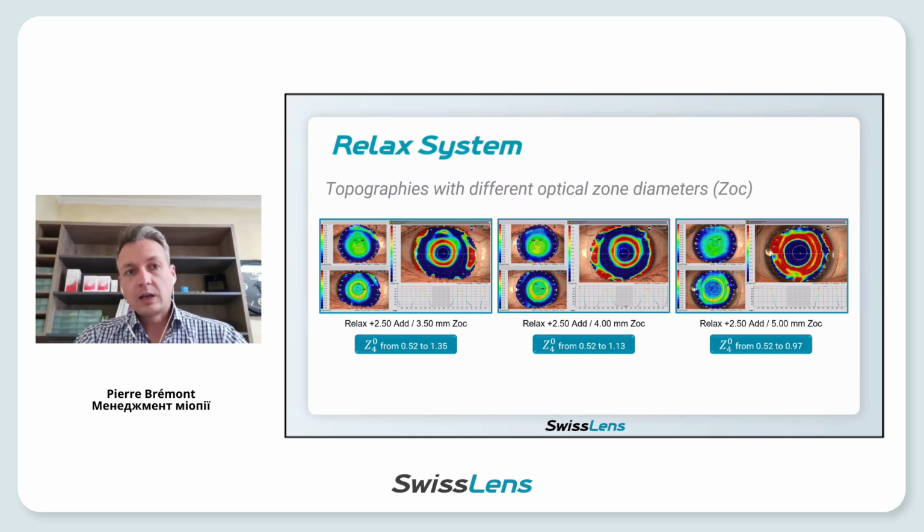So you could tell me, okay, we can make all the patients with 3.5 millimeters in central optical zone. And yes, but when you make a higher spherical aberration, you also decrease the visual acuity, and sometimes the subjective comfort in vision of the patient is lower.